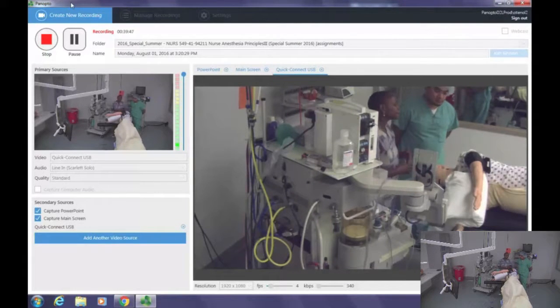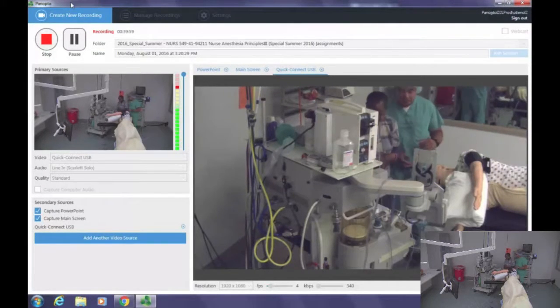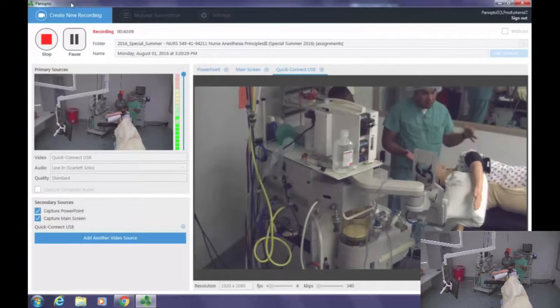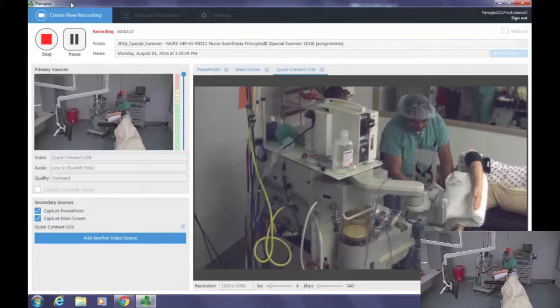Once the doctor makes the incision, we go to the next step, which is one lung ventilation. To achieve that, basically you need a suction and a clamp. The surgeon will ask you to drop the lung. We're going to operate on the left lung, so clamp the left, and then basically suction the air contents of the left lung. So now I'm going to suction the air, and right now we're doing one lung ventilation.